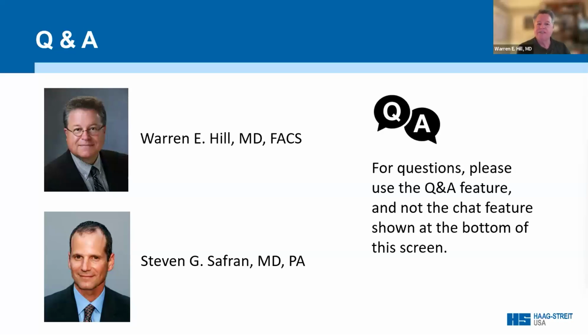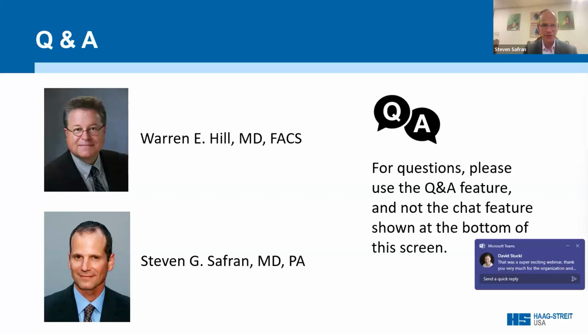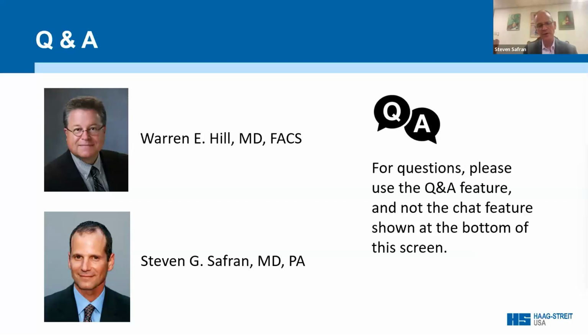Well, go ahead, Steve. Well, the Barrett formula uses algorithms to estimate the posterior cornea, and it's based on many different factors, including anterior cornea curvature. He's basically come up with an algorithm, and it turns out that the algorithm is very, very close, if not just as good, as actually measuring the posterior cornea in the reality of using the lenses that we're using, which come in rather large steps. So the total K versus the Barrett formula, I haven't really been impressed that it's really that critical a factor with the toric lenses we're using.